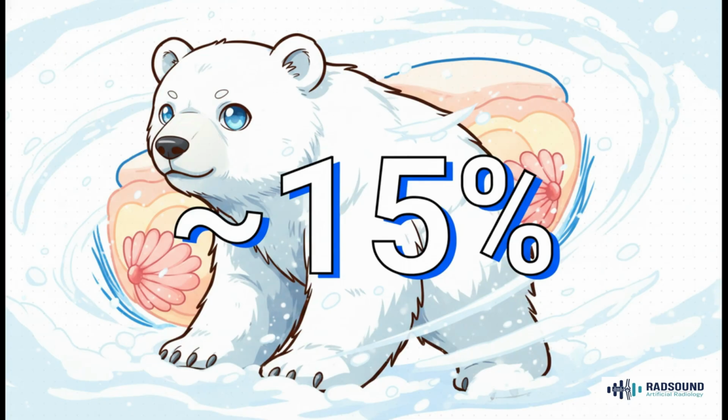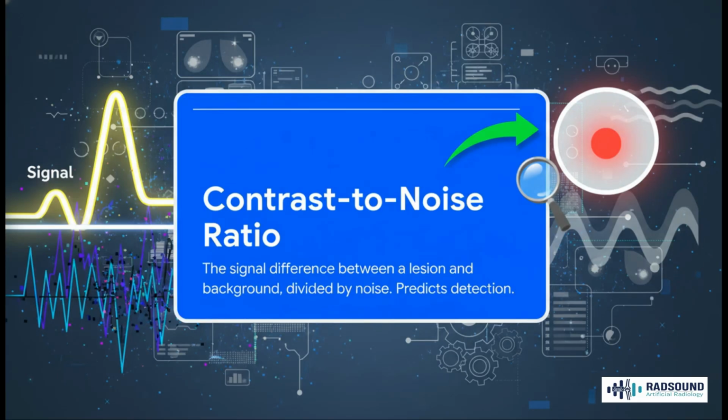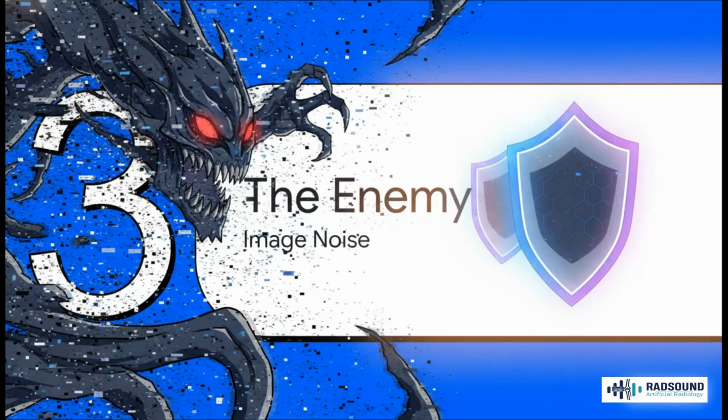Now for contrast. And this is where it gets really, really tough. The natural, inherent difference in X-ray absorption between cancerous glandular tissue and the surrounding fatty tissue is only about 15%. That's it. This is the lowest subject contrast of any imaging exam we do. It's like trying to find a polar bear in a snowstorm. And this brings us to the metric that truly matters in the clinic, the contrast-to-noise ratio, or CNR. Because it doesn't matter how much contrast a lesion has if it's completely buried in noise. CNR is what tells us if the signal, the potential cancer, is actually strong enough to rise above all that static and be seen.